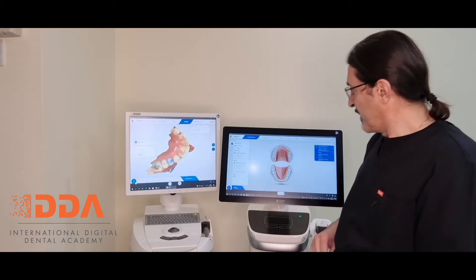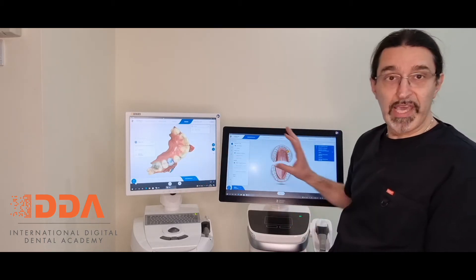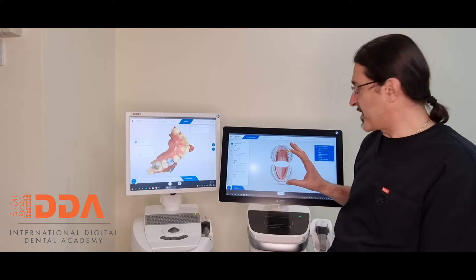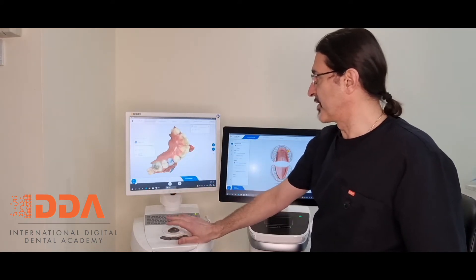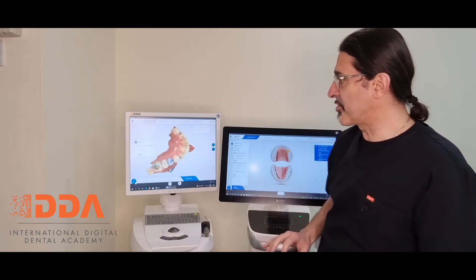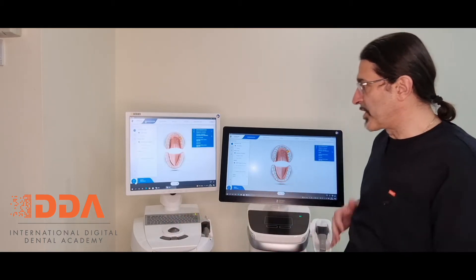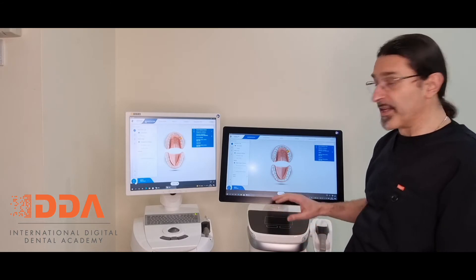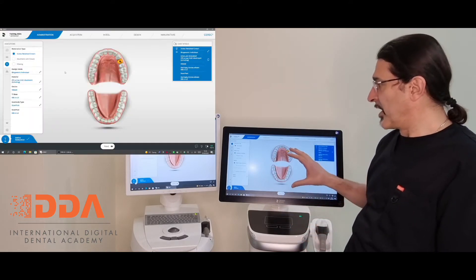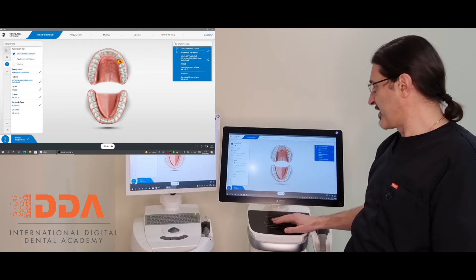Let's see how we set up the case in CEREC. When we start up our start screen, whether you're using Omnicam or Prime Scan, we have the exact same setup options on the main screen. Let's go back to the administration phase. The first thing we're going to do is determine what restoration we're putting in the patient.